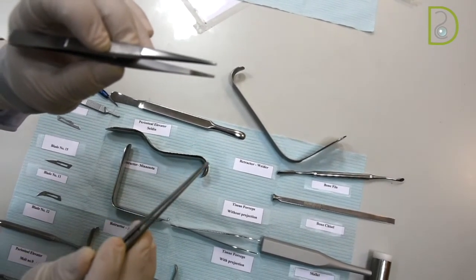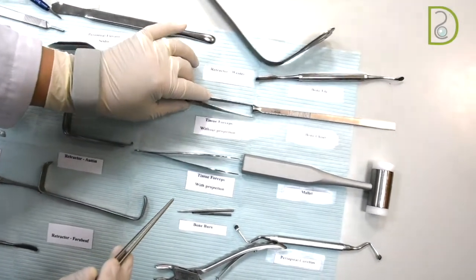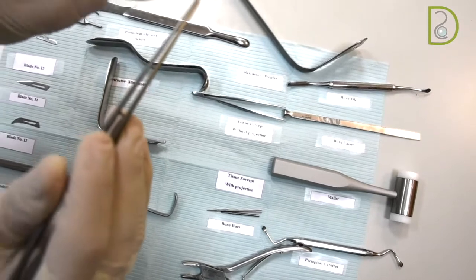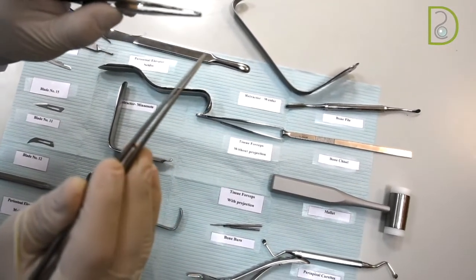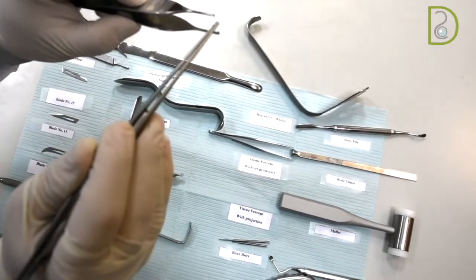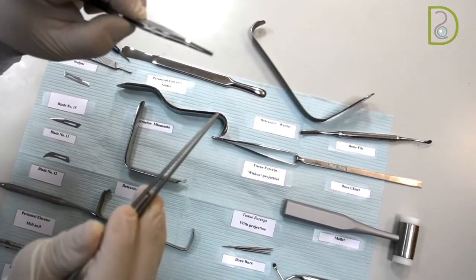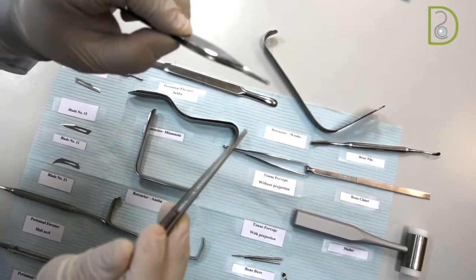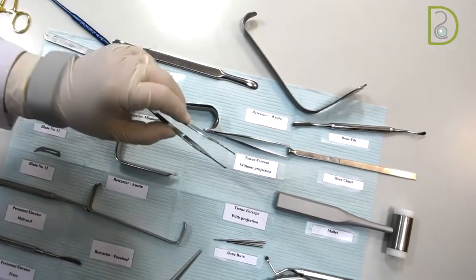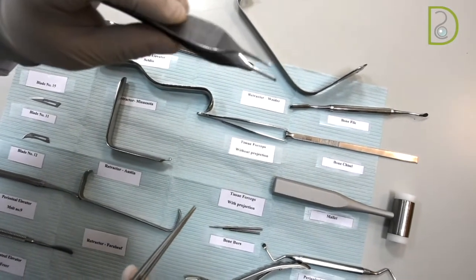But to ensure that even more securely, use the tissue forceps with the projection. And this will lock into male and female projections that will meet each other to ensure and secure the holding of the tissue tightly. So this is the tissue forceps with projection.